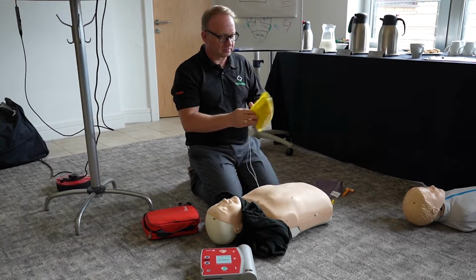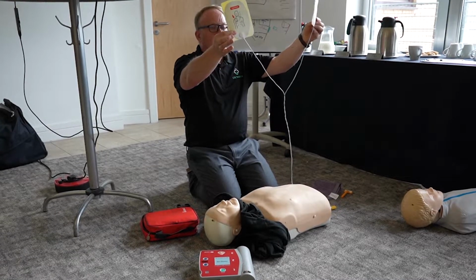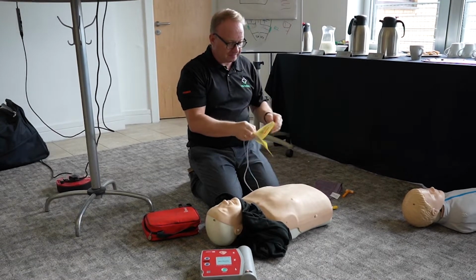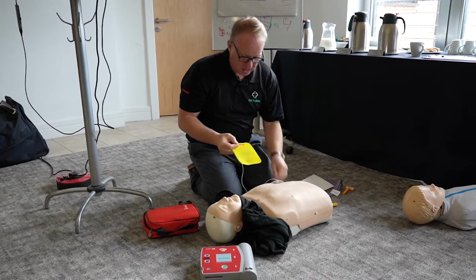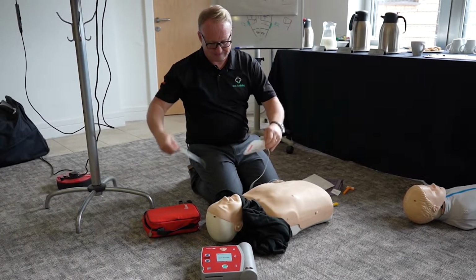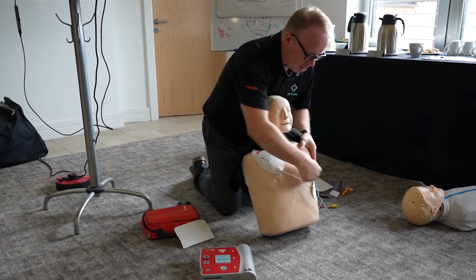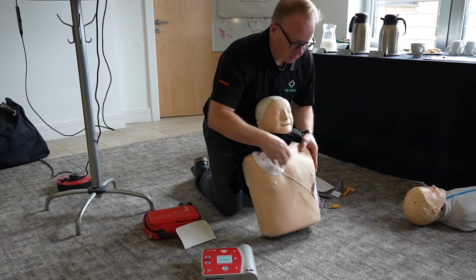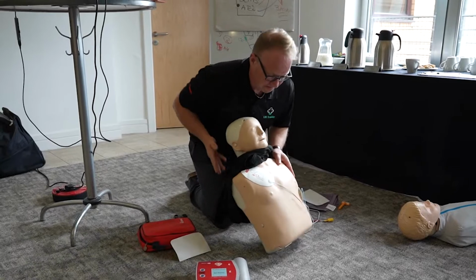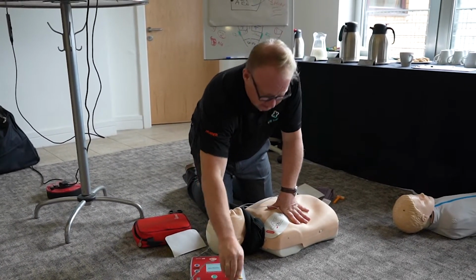Apply pads to patient's bare chest. Plug in pads connector next to flashing light. It shows you where to plug it in. So one goes here, one goes here. Apply pads. Plug in connector. You see? It arcs across and back again. Heart's here, shocks straight across the body. Plug it in. Apply pads. Plug in connector.